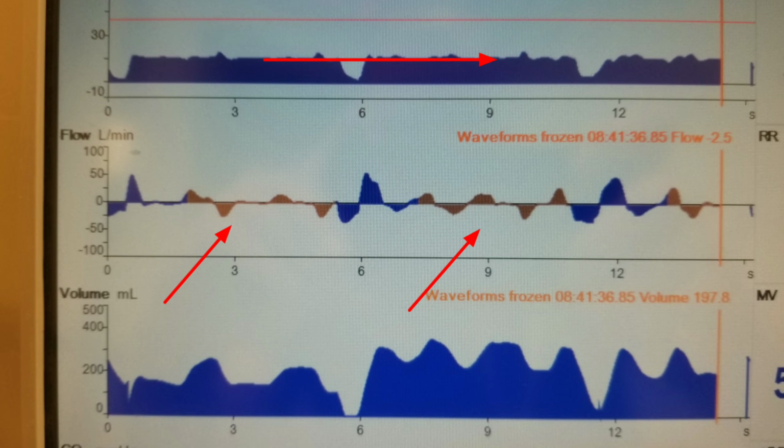You may also see, when you're on the P high, that there's literally an erosion of that CPAP level. When the CPAP level, the P high, is not set high enough, you might have the patient sucking down that CPAP level, eroding it, just trying to generate that high flow, and they're sucking back and pulling down the P high. That's an indication probably that you're very, very low on your P high. You should be going higher.